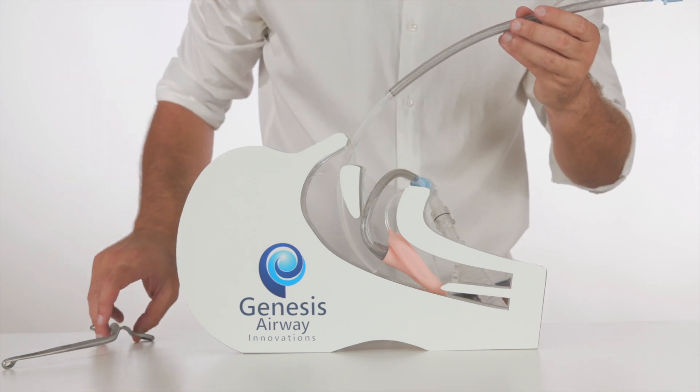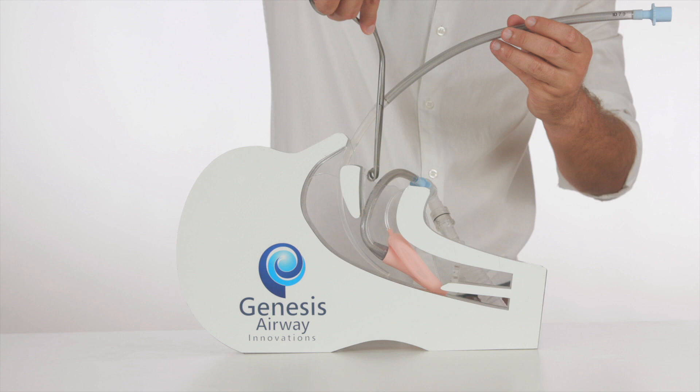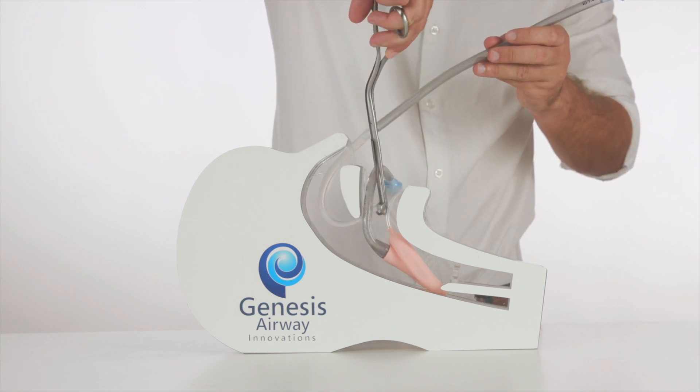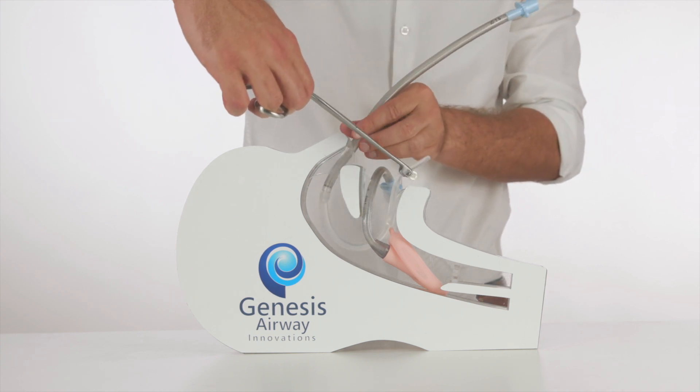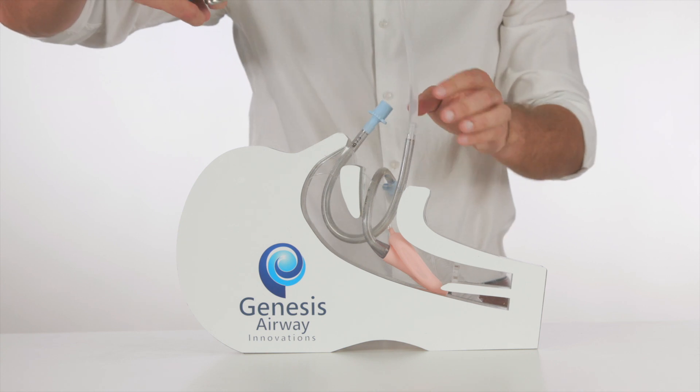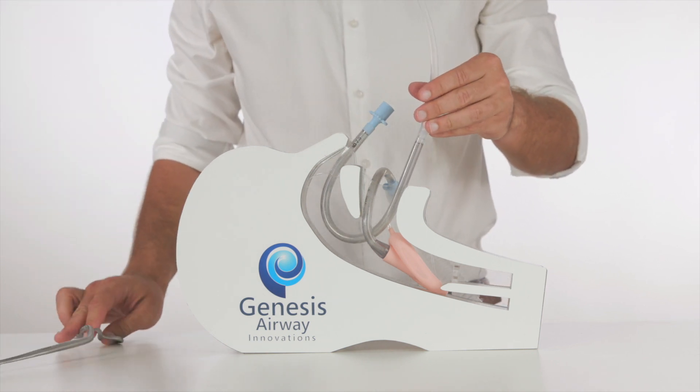Once visible within the oropharynx, the introducer is then retrieved with McGill's forceps, applying very gentle traction whilst continuing to advance the airway tubing through the nose. At this point, we are then able to remove the introducer with a gentle twist.